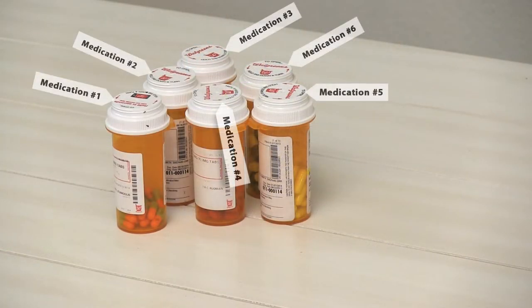For this patient, six medications are taken each day, some of them once a day and some twice a day.